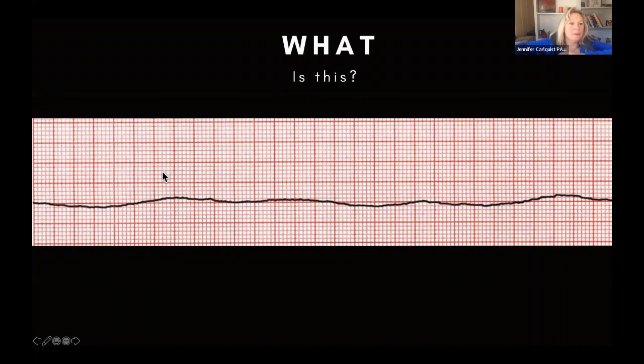So that's a good point. And most folks are saying asystole. And the folks on Zoom and Facebook are both saying asystole. But we do have one fine Vfib. And to that, I'm going to tell you that whoever said fine Vfib, you could potentially be right. And this one's a tough one, right? Because there is a little bit of electrical activity, but you're probably safest treating it as asystole. Okay, so nice job, you guys.